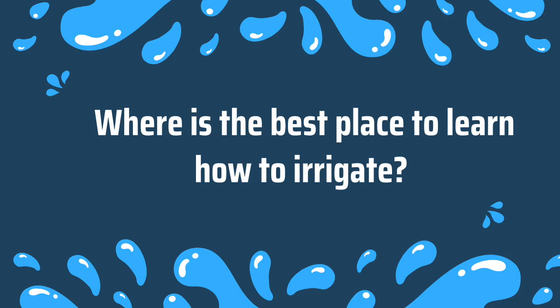Where's the best place to learn how to irrigate? I feel like the ideal place to learn is in the bathroom where you're going to irrigate. I've provided instruction and demonstration to patients in the hospital, in their home, and in my clinic. And I've found that people are always more comfortable in their own home, in their own bathroom, where they know where everything is. Because an important part of learning how to irrigate is figuring out how to organize the supplies in your bathroom.